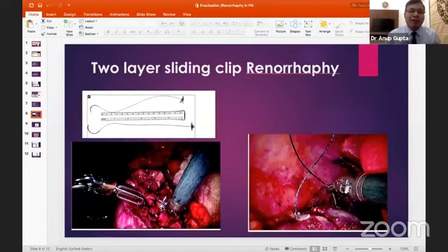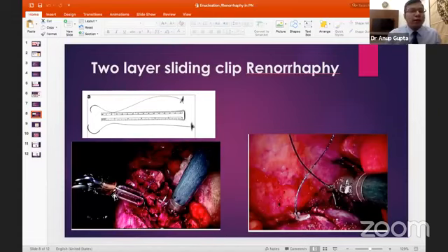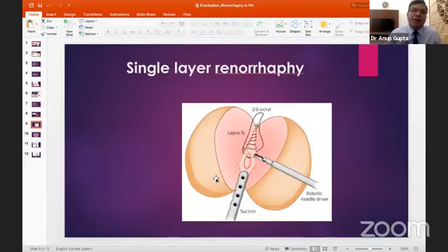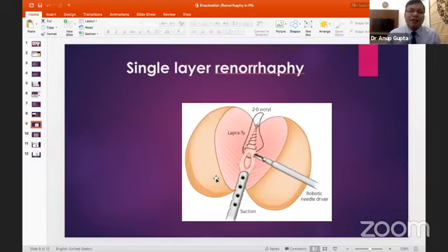This two-layer continuous suture technique is currently the most favored method used by surgeons across the world. A single-layer technique using only the internal layer with Vicryl or V-lock may be essential when dealing with central hilar tumors where closure of the outer capsule is not possible.